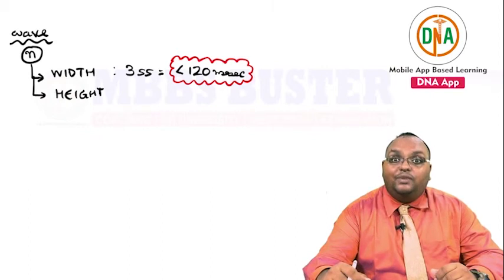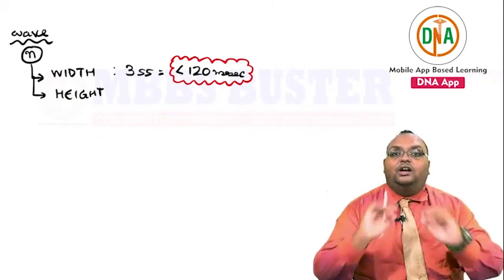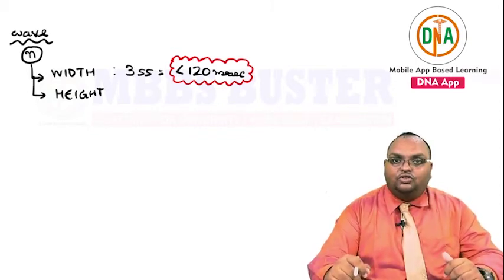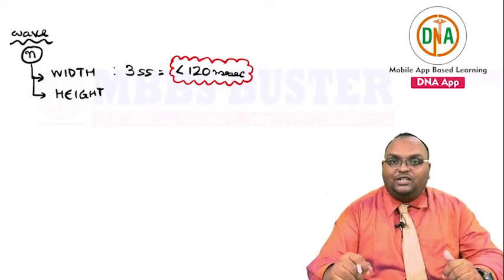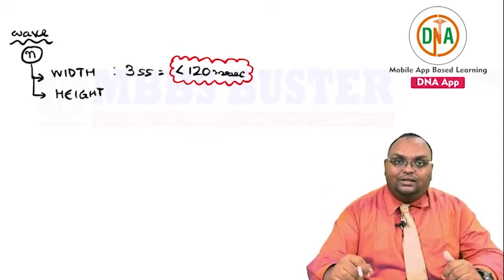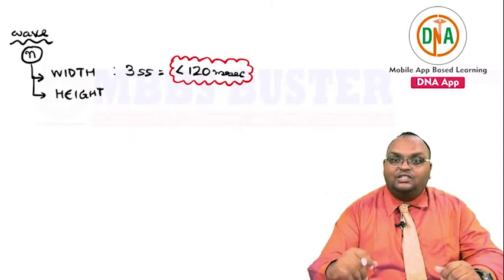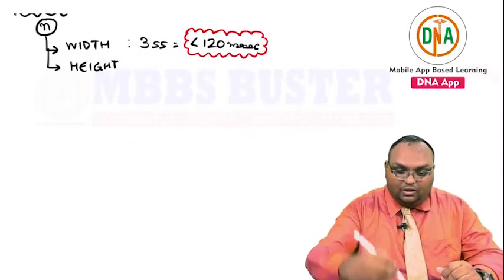wave, because the P wave depicts atrial depolarization, and as you know, the atria are more inclined posteriorly, closer to the limbs, so the magnitude of the atrial activity would be better depicted by the limb electrodes. So we would have a higher cutoff for the P wave in the limb electrodes than the chest electrodes, right?